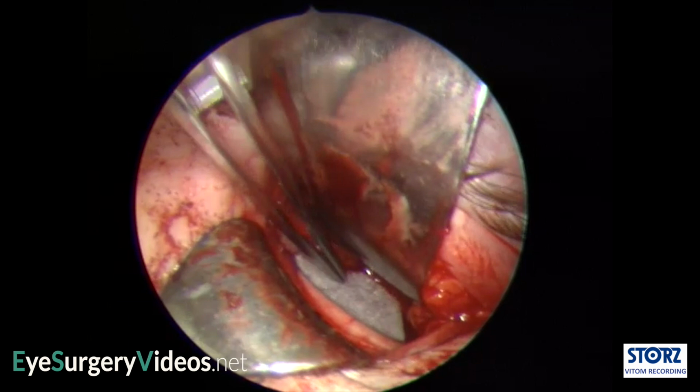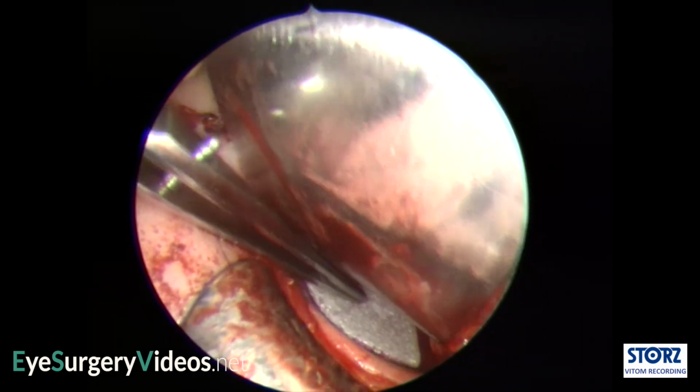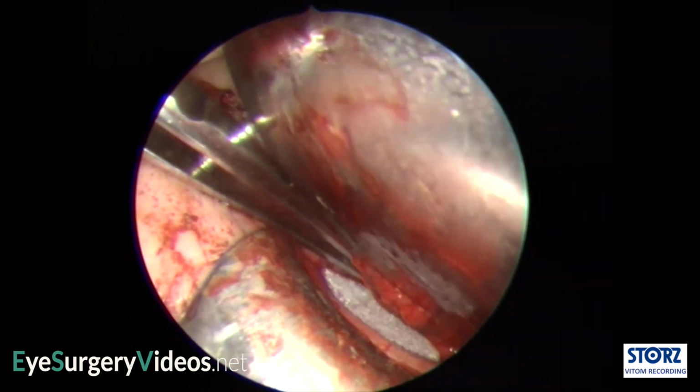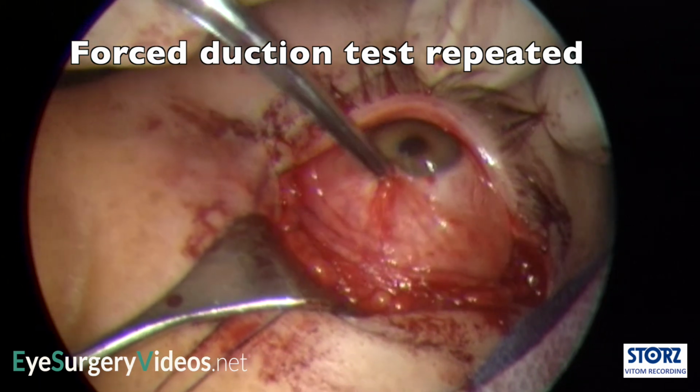The integration of the implant can be both an advantage and disadvantage, as it is thought that it reduces extrusion but can make it more difficult to remove if necessary. However, most implants have very low complication and extrusion rates, so generally one type is not universally favoured, and the choice can be surgeon and patient specific. The sizing and positioning of the implant is much more important than the material selected. A template can be made or the size estimated.